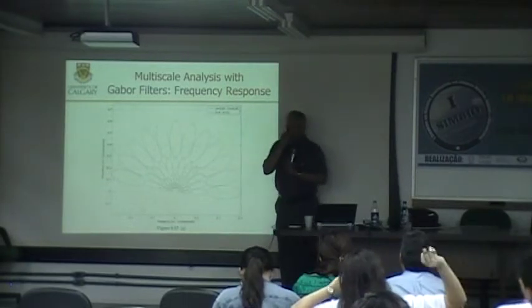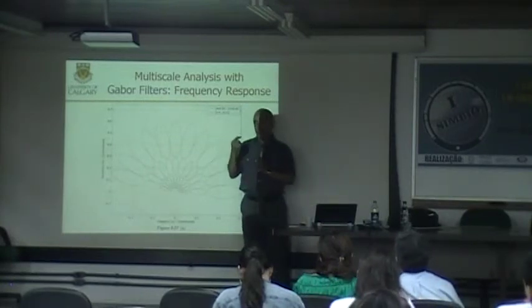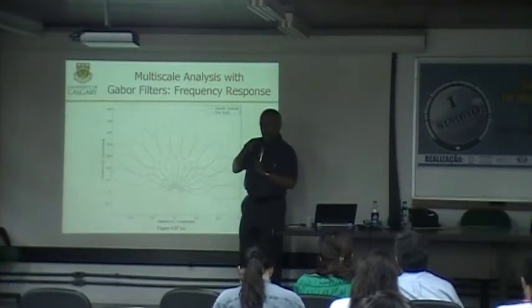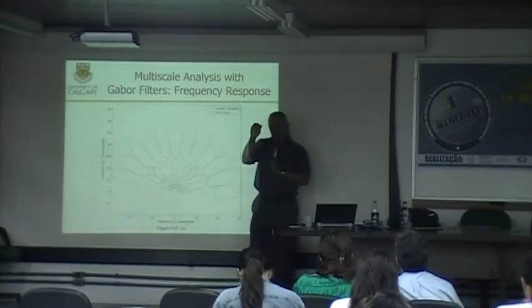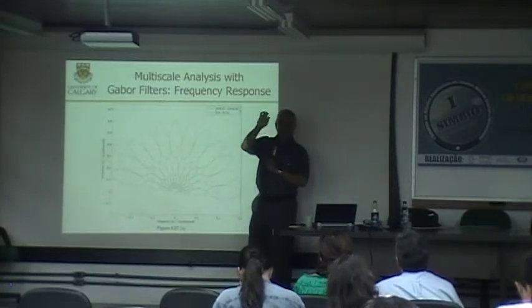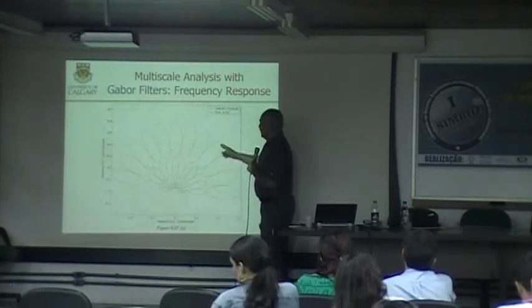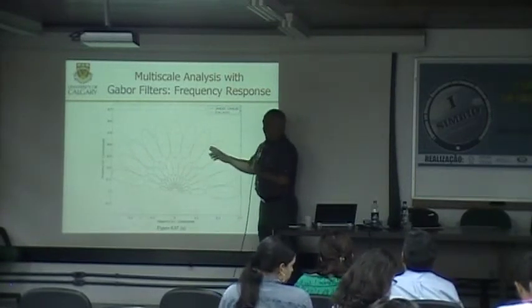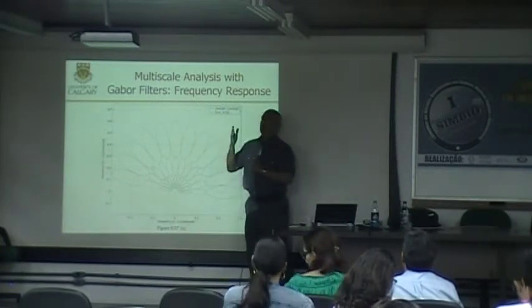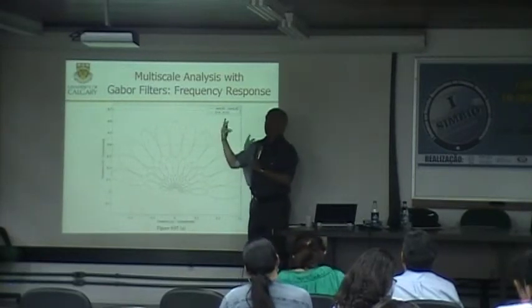It depends on the application. In the case of architectural distortion, we are analyzing mammographic parenchymal patterns. In discussion with Dr. Desautels and looking at the images, we said the average thickness of these fibers that we see is about 200 micrometers. Gabor filters can detect with one scale and with an efficiency of more than 90% approximately, 1/4 of that average to 4 times that.